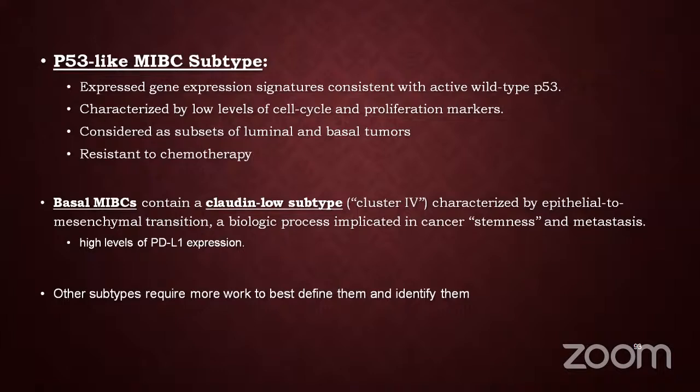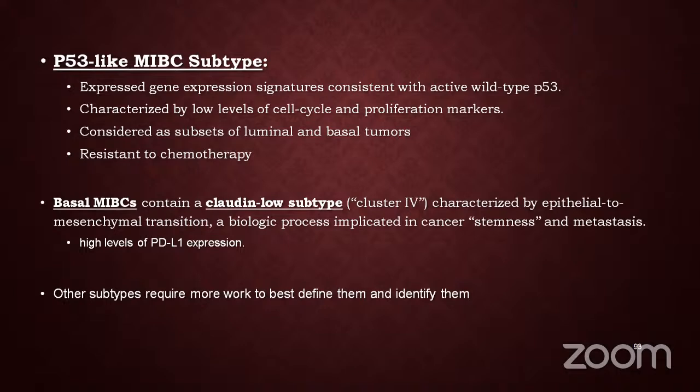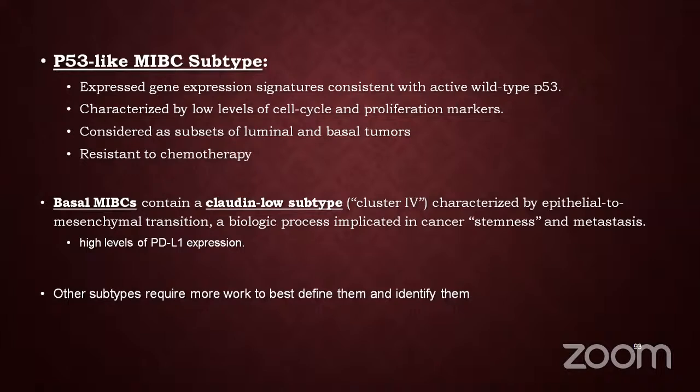Therefore, your percentage of sarcomatoid differentiation and what type of sarcoma is very important to tell your oncologist. In normal bladder epithelium, if you do P53 staining, I see, it will be negative. It will not be negative. You see some positive cells, some negative cells confined to the basal cell layer. The wild pattern is not completely negative. If it is completely negative, then there is a truncation mutation or a deletion mutation involving the TP53 gene. Therefore, the protein is not expressed at all. So complete negative is a null pattern of mutation. So it should be some positive nuclear, some negative nuclear. Yes, you have shown that.